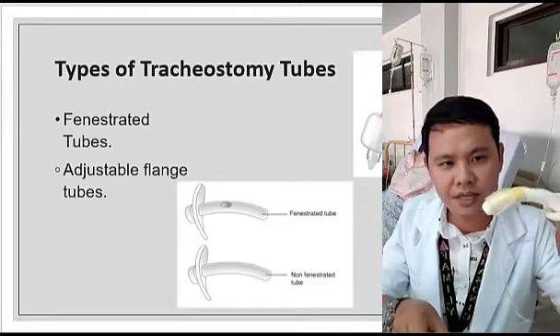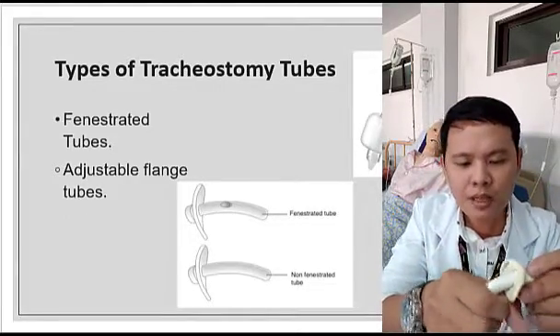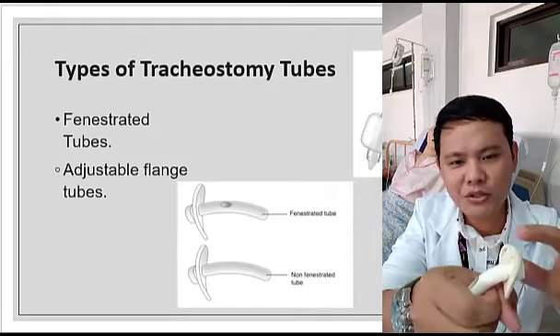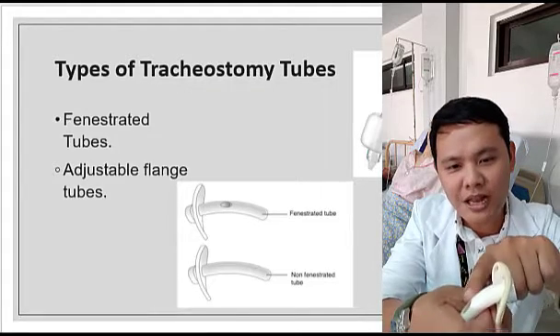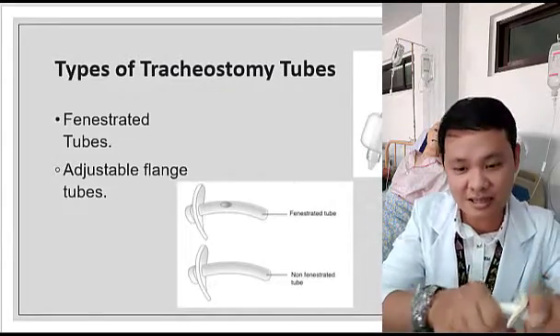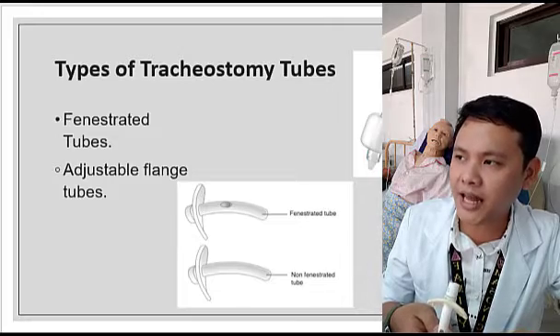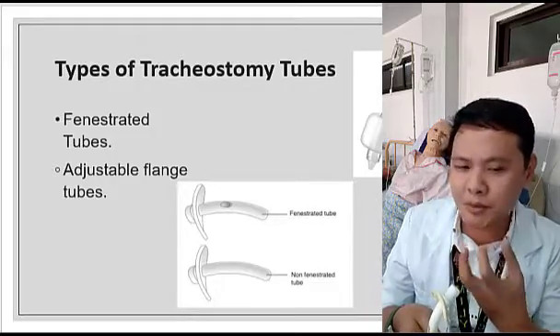Okay? If itong tracheostomy na to, pumasok po rin sa may trachea, okay? Okay, pinasok dito. And then, tinanggal natin itong inner cannula. Okay? What do you think is going to happen? Dito ba lalabas yung air? No. Dito po lalabas yung air. So, meaning to say, ang pasyente po natin na meron pong fenestration or fenestrated tubes, pwede itong gamitin if the client wanted to practice speaking. Also, if the client wanted to know kung kaya na ba niyang makapagsalita or kaya na niyang makahinga sa may bibig or sa may ilong.